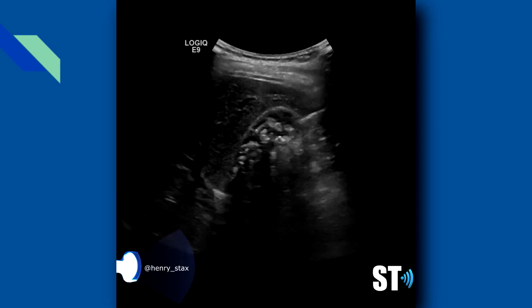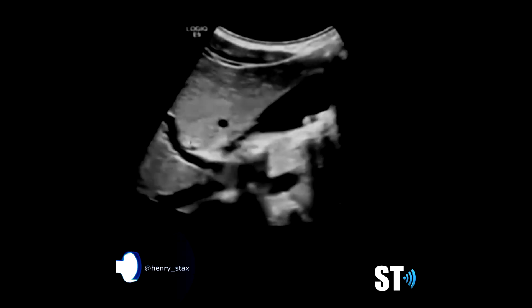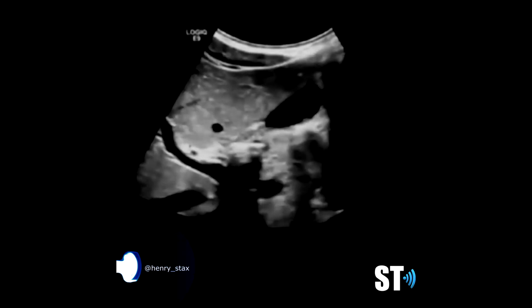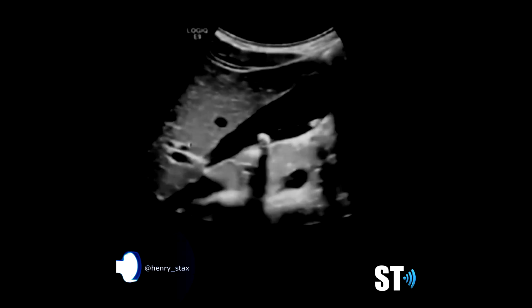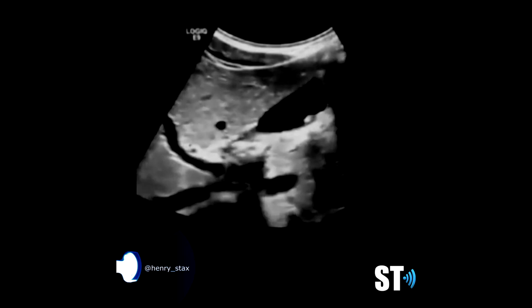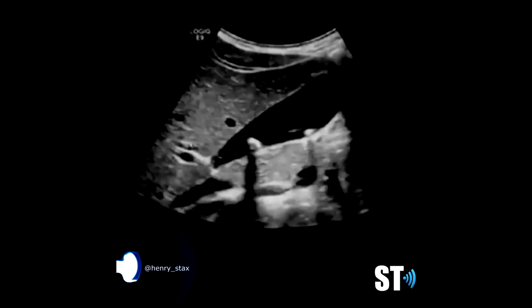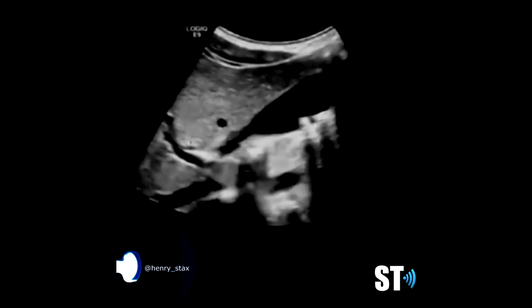Mobility of the stone can be observed by scanning the patient in left lateral decubitus as well as supine. Scan the intra- and extrahepatic biliary tree to look for dilatation, stones, or both.